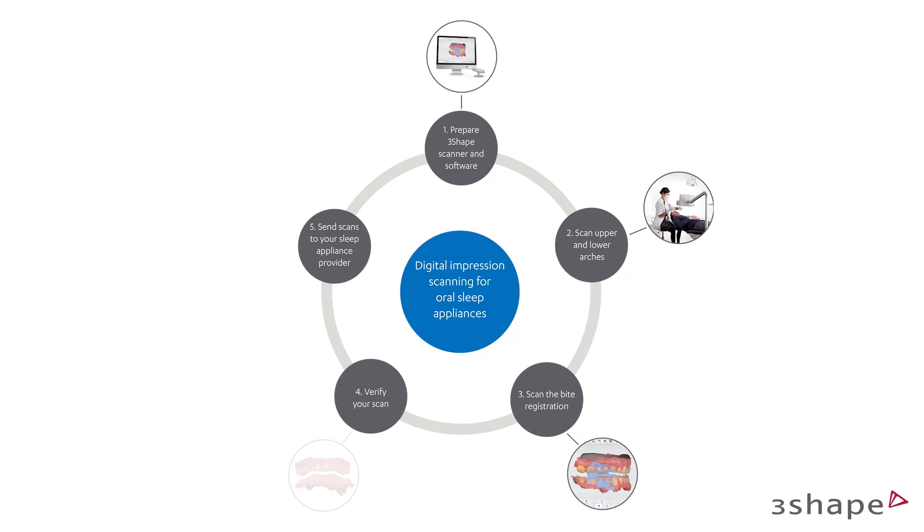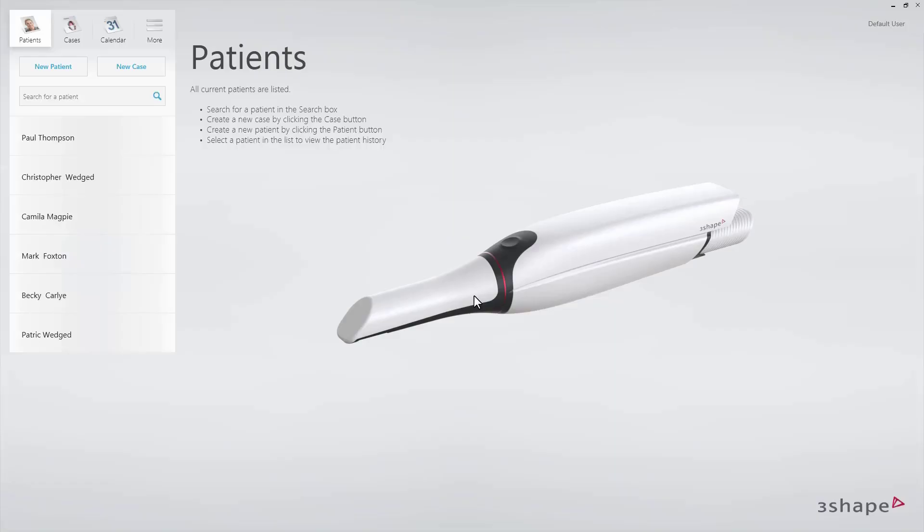Before you proceed, please set up the connection to your sleep appliance provider within 3Shape Communicate and make sure that their lab is available in the order form step. Start from setting up the case.